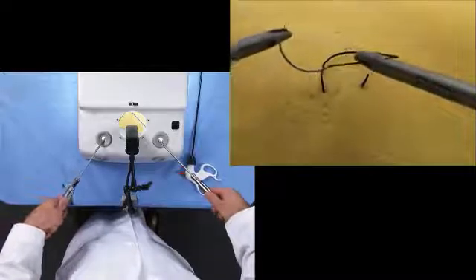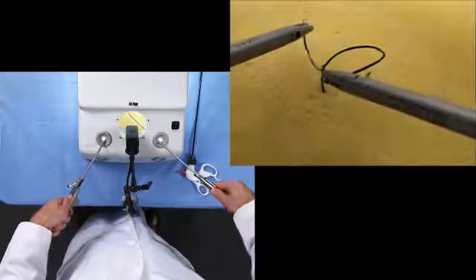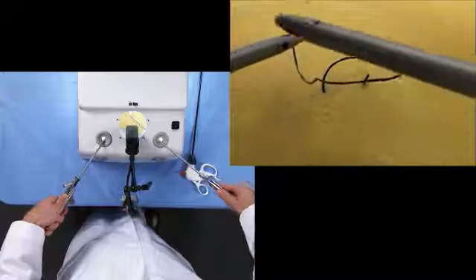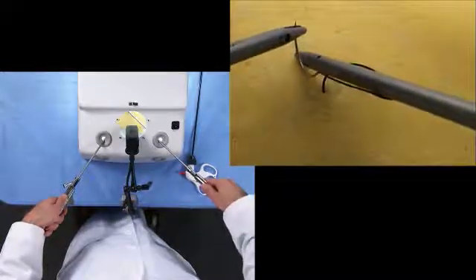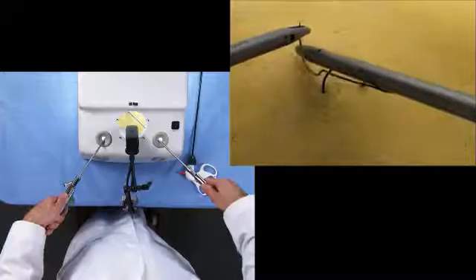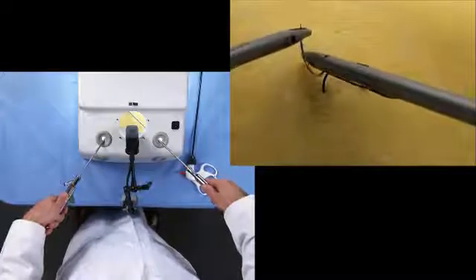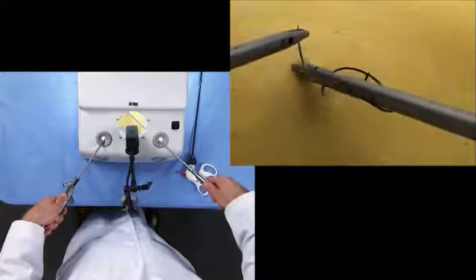We'll swing the swedge in to create a 45 degree angle between the long axis of the needle driver and the needle itself. This will place the right needle driver roughly parallel to the needle itself.